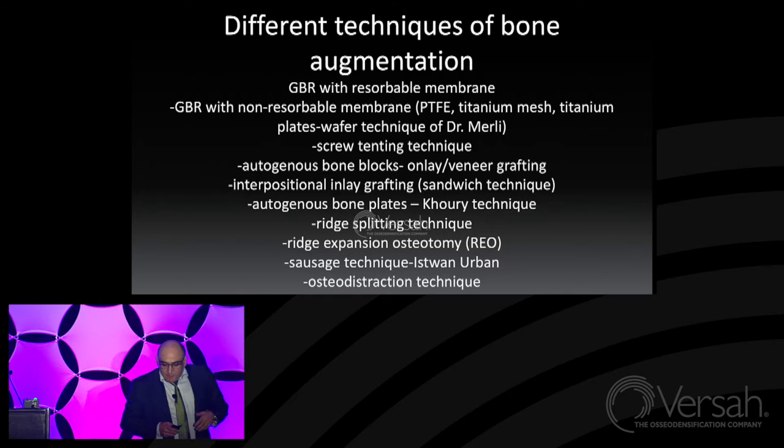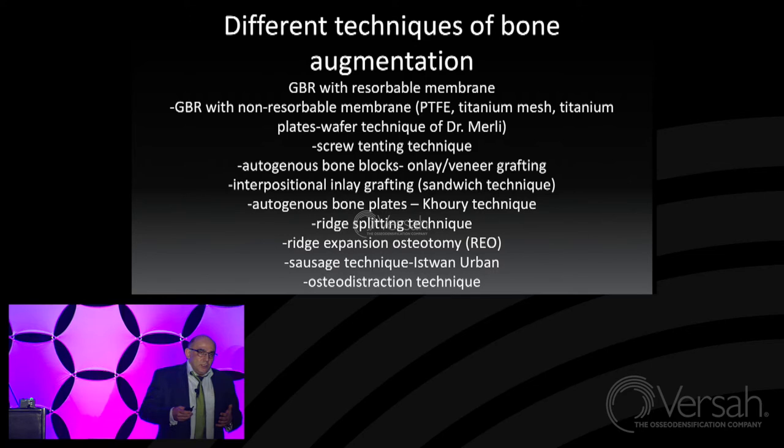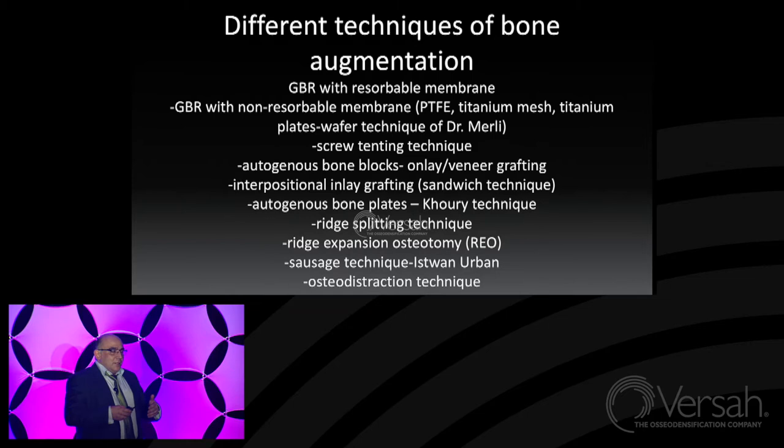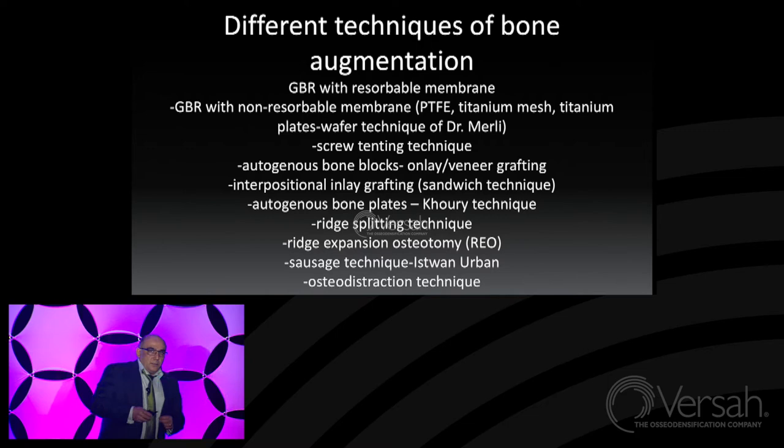All these techniques have only one purpose: to create enough bone around the implant to be stable for a long period of time, which may allow us to be sure that during 10, 20 years, the implants which we place in the bone of the patient will survive, and we will be happy with the result.